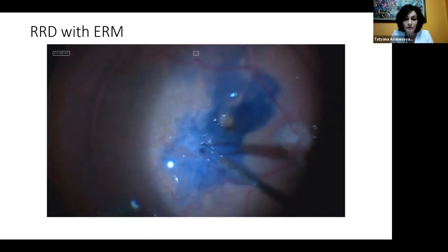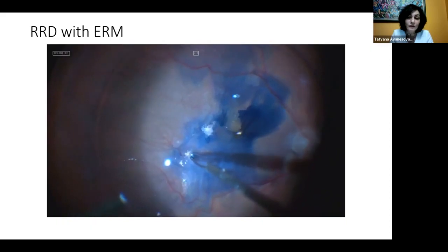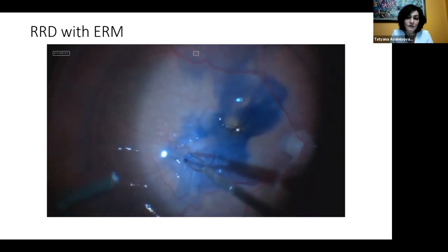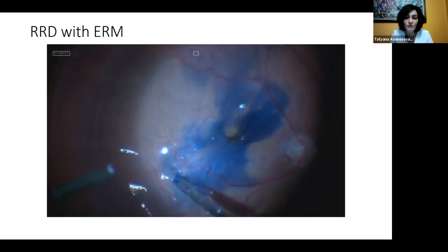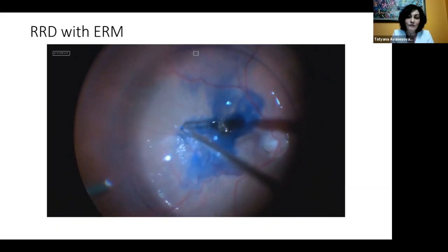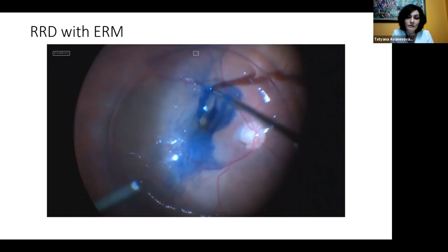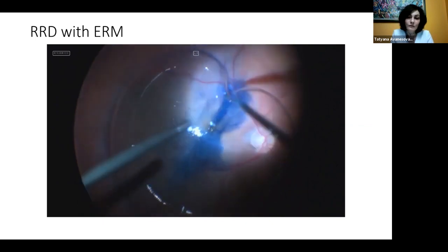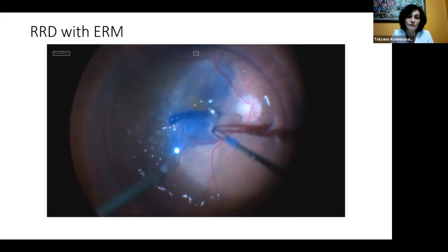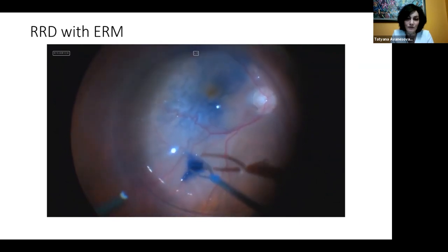I remove the epiretinal tissue, and I can do it carefully. The retina is attached under the PFCL, and my actions are horizontal, and of course, there is some weight of PFCL, but I can control the removing without any damage, without any iatrogenic breaks on the periphery, which could happen if I would do it without PFCL.